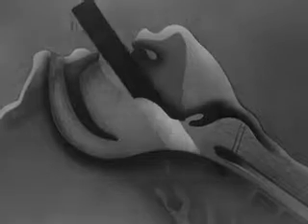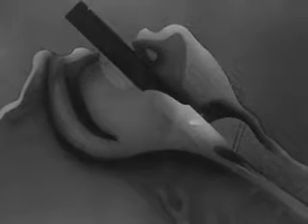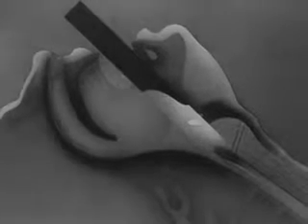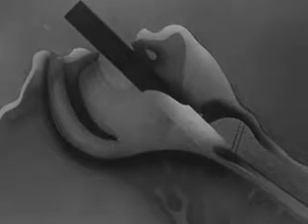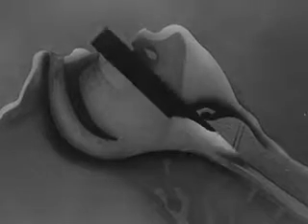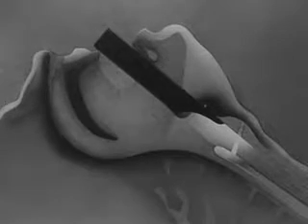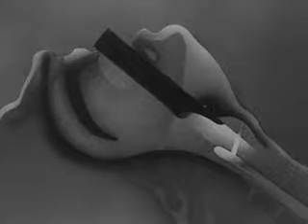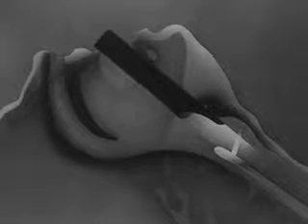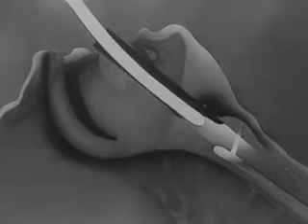When it has reached 2/3 of the full distance, the epiglottis is seen. When this appears, the laryngoscope should be gently advanced and the epiglottis lifted and held by the tip of the instrument. Finally, the glottis and vocal cords come into view. So long as the glottis is open, the tube can be passed along the lumen of the laryngoscope into the larynx.